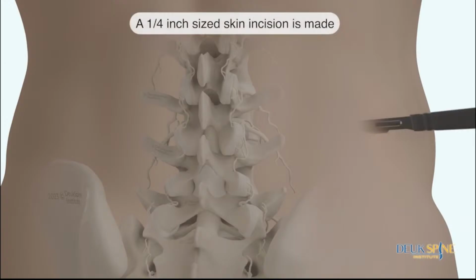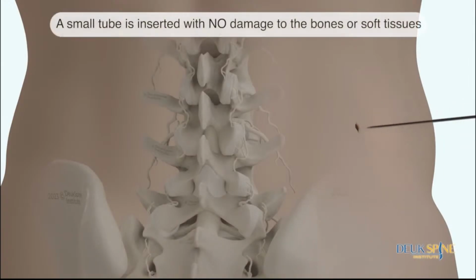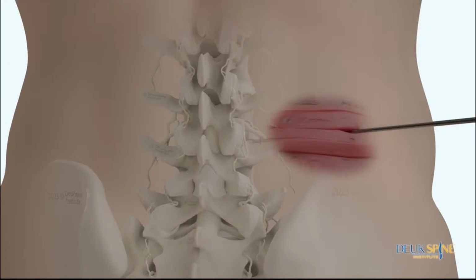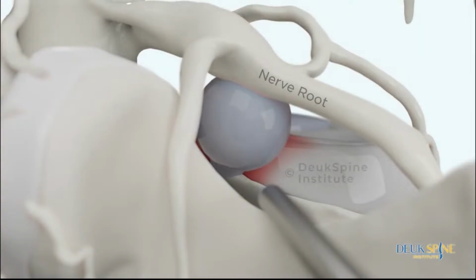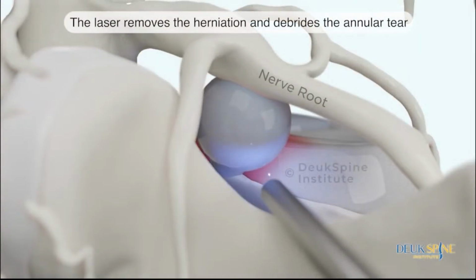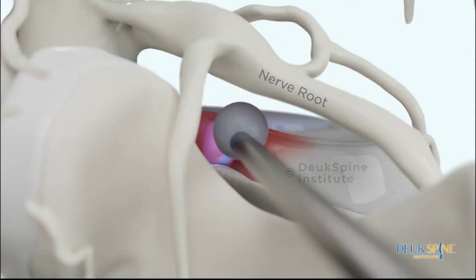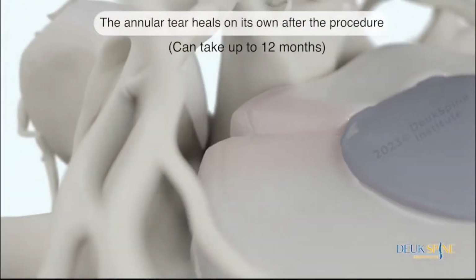A 1/4-inch skin incision is made. A small tube is inserted with no damage to the bones or soft tissues. The laser removes the herniation and debrides the annular tear. The annular tear heals on its own after the procedure, which can take up to 12 months.